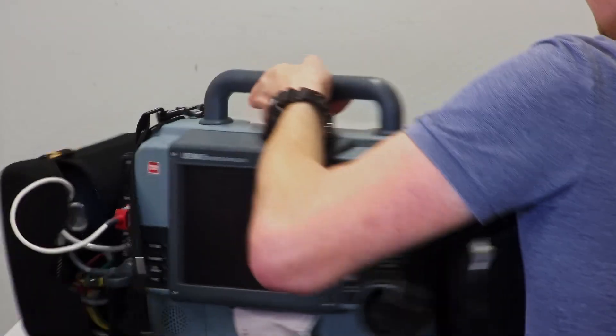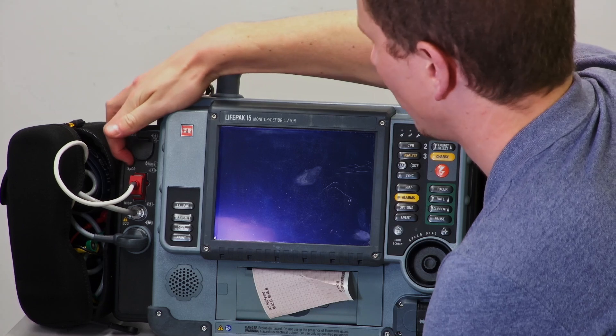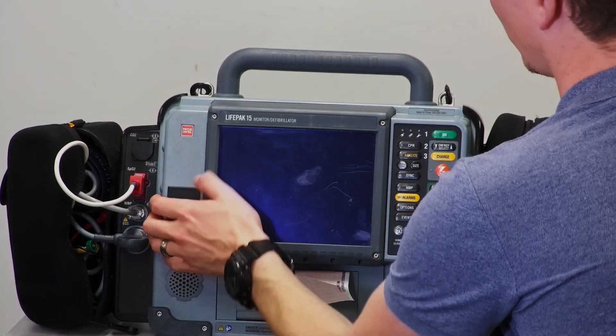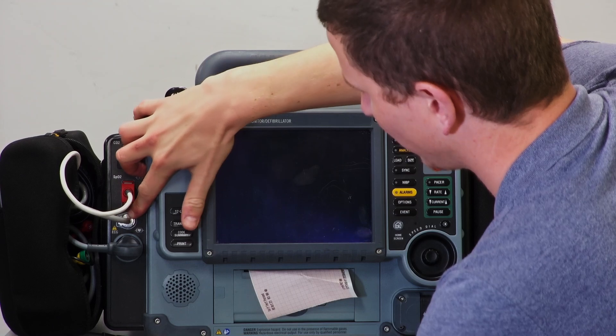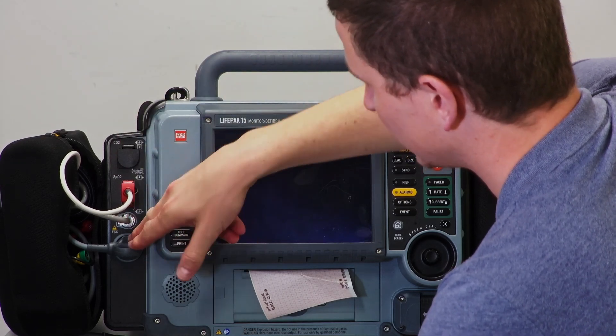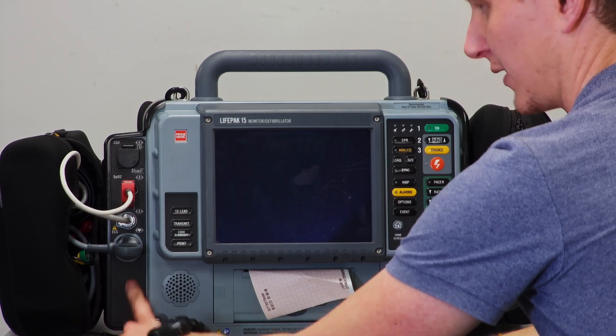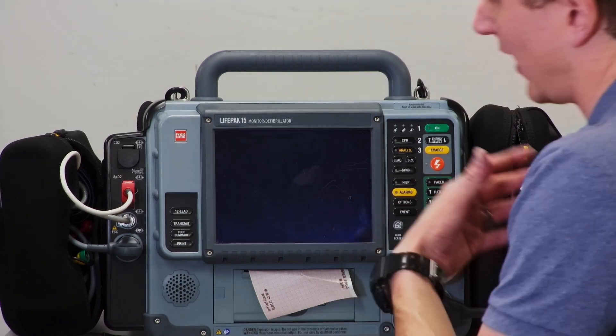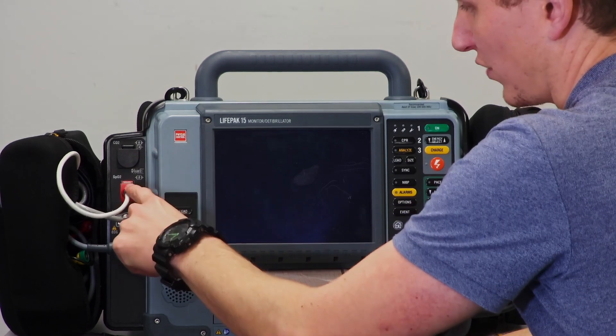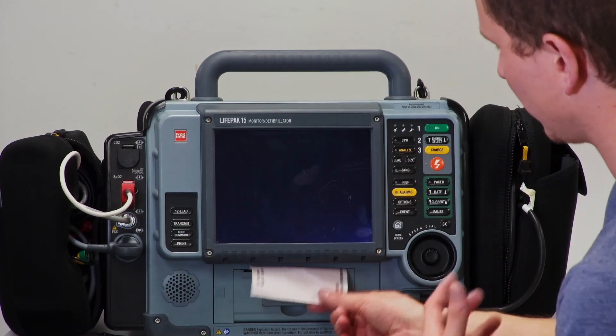On the side here, at the top you have your ETCO2 or capnography port, then your SATs probe, your BP cuff for your NIBP or non-invasive blood pressure, your ECG leads, and some monitors have invasive blood pressure monitoring at the bottom depending on the model and what modules you have. Some don't have capnography or the SATs probe—they just have ECG—and some have more, so it depends on what you have.